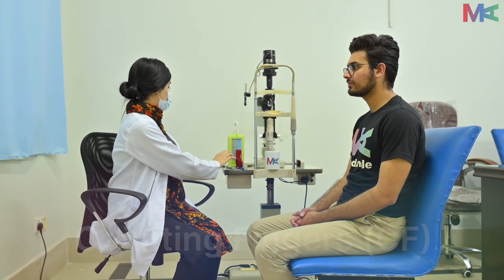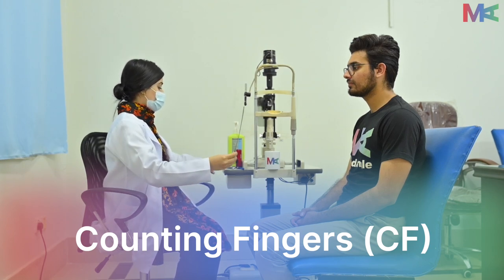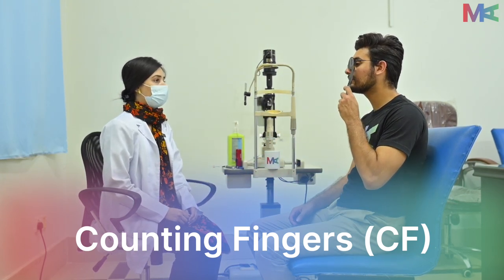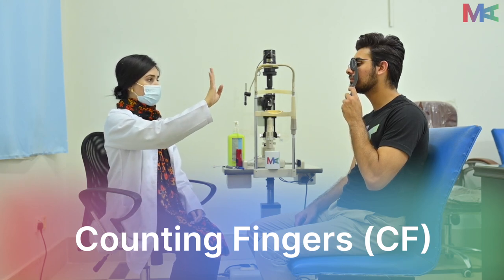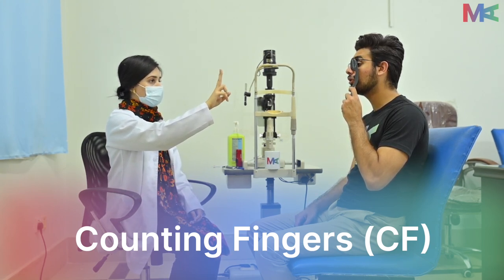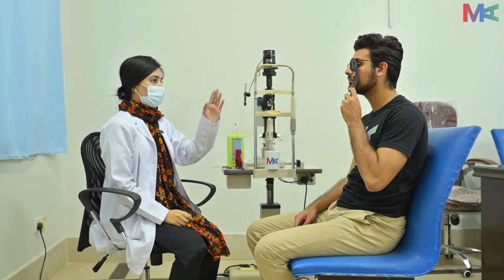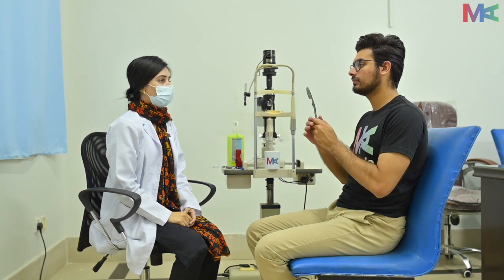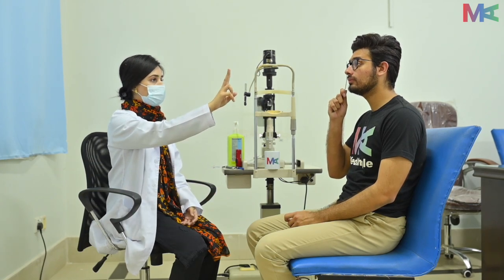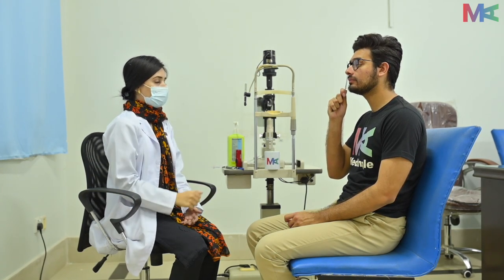Isse aap apni ulti aank cover karein. Yeh mujhe batayen kitne ungliyan hain. Chah. Do. Eek. Theek hai. Ab apni seedhi aank pe rakhein. Yeh batayen. Do. Teen. Eek. Theek hai.